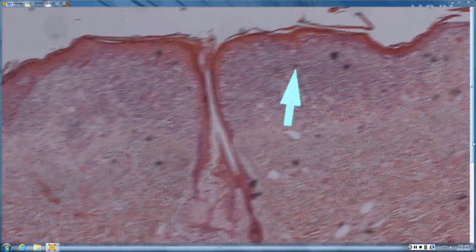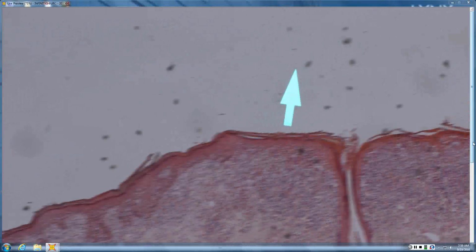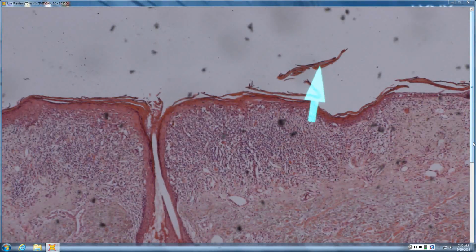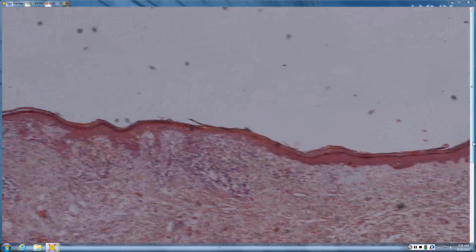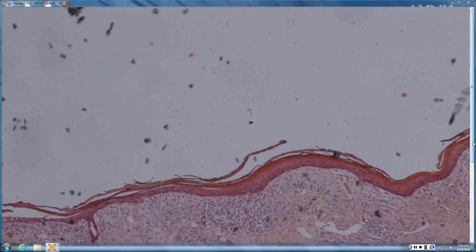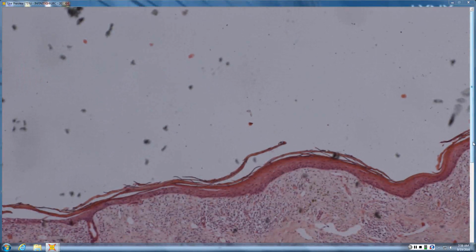LPLK. So it could be a BLK, and one of the hints to a benign lichenoid keratosis, same thing as lichen planus-like keratosis, so BLK or LPLK, same thing, is your corneum tends to be mixed. So you look at different areas, and the nature of the corneum changes. In some areas it's crusted, some it's parakeratotic, some it's looser, some it's denser. That change in corneum across the surface is a hint to be okay, whereas most other lichenoid processes, the corneum's pretty uniform from left to right.